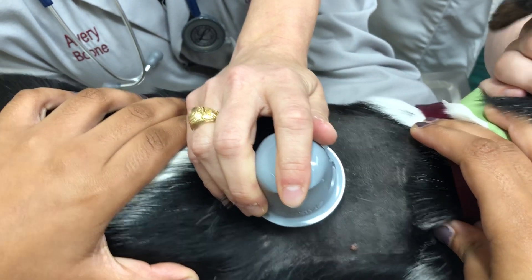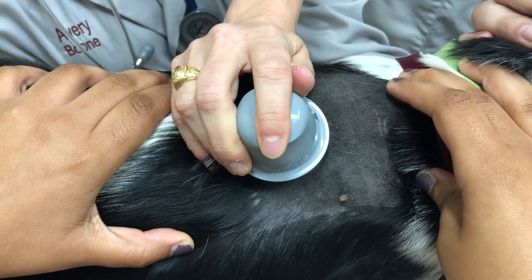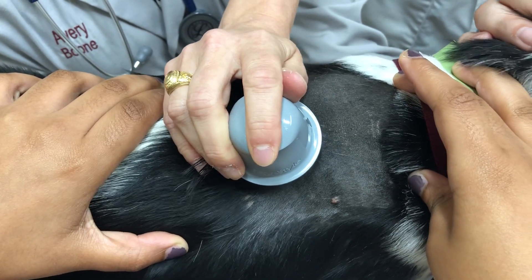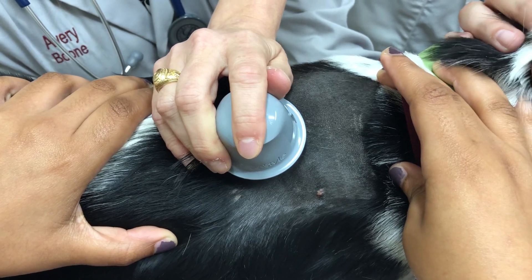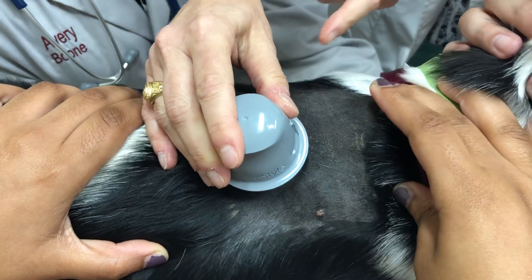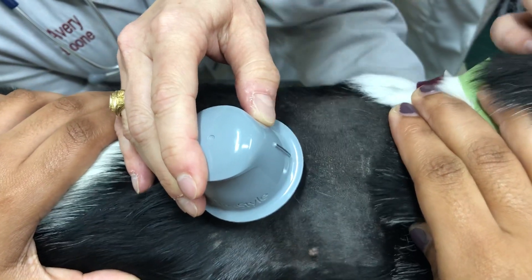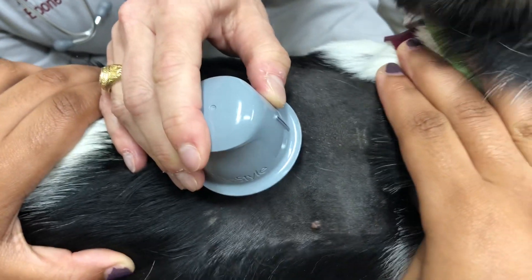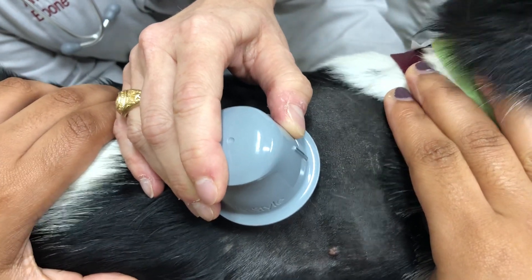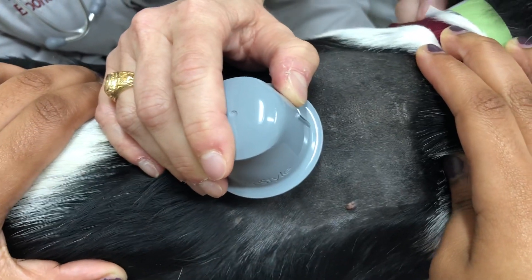When we finish holding for 30 seconds, we have to take the device off. Ideally it would come off really easily, but what we've found is we need hemostats to help push it off. The place to use the hemostats is where the gray line is, because there's a little divot there that we can use to pry off the sensor.